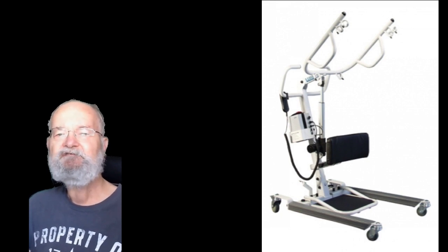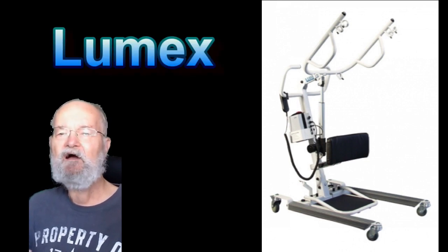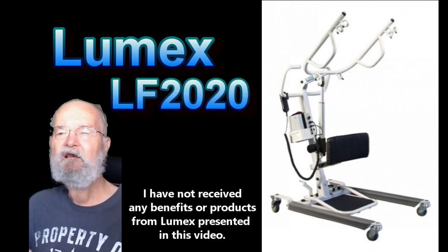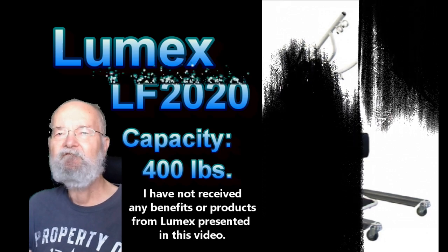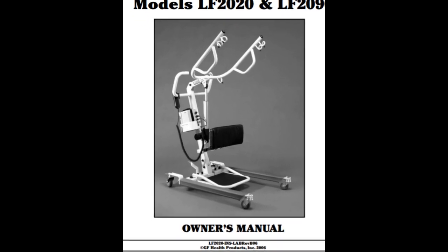First of all, to answer some future questions about the model sit-to-stand lift that I purchased 3 years ago and will feature in this video, it's one made by Lumex, and it's the model LF2020 with a lift capacity of 400 pounds. Let's start with the adjustments required before using a sit-to-stand lift.